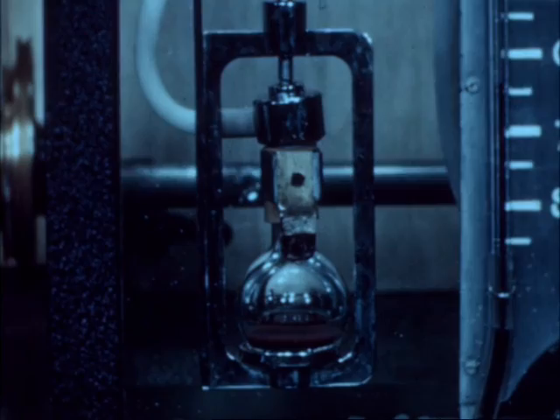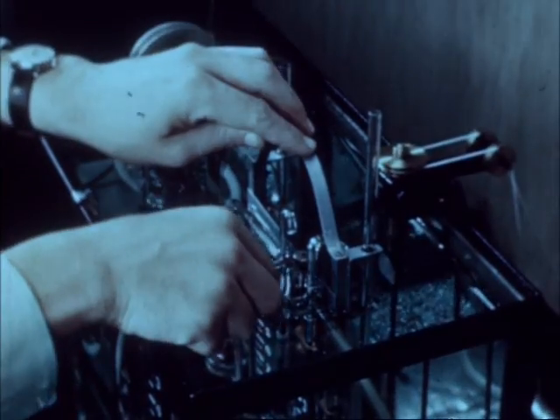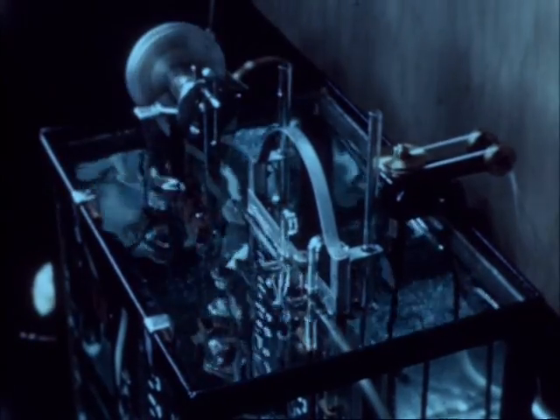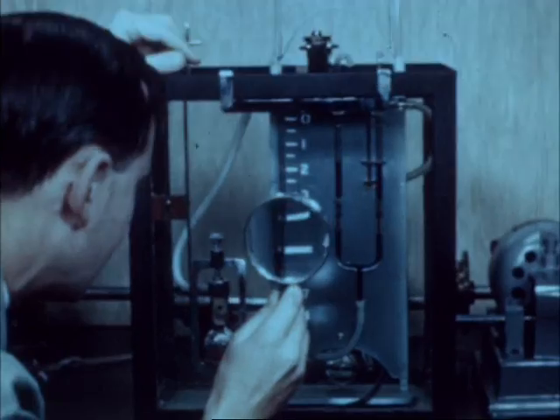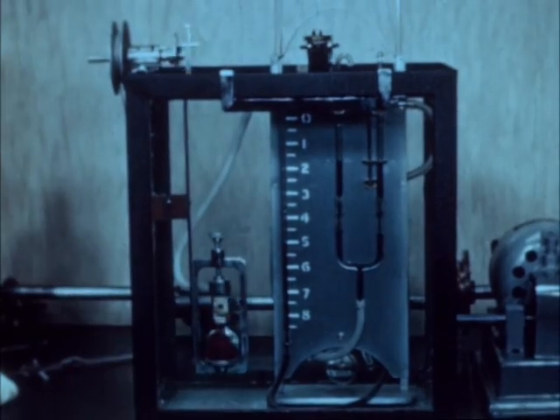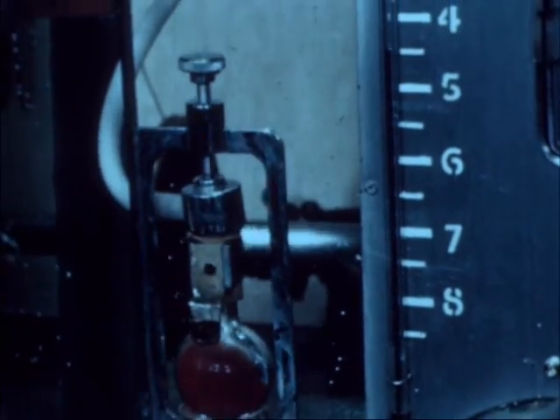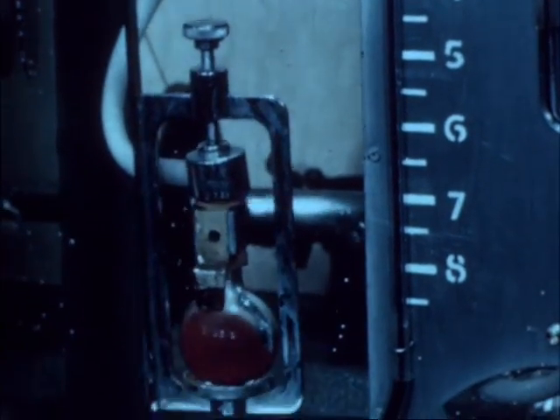When temperature equilibrium is ensured by testing during temporary closure of the taps of the apparatus, the taps are finally closed for the analysis. The reading on the scale of the calibrated pipette is exactly 0.500 cubic centimeters. The bottle is then shaken automatically by engaging a clutch, and the absorption of oxygen by the sample is indicated by the rising fluid level in the measuring tube. Complete saturation with oxygen is indicated by cessation of upward movement of this fluid column.